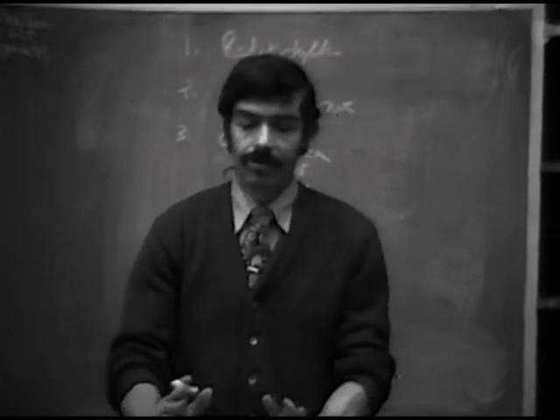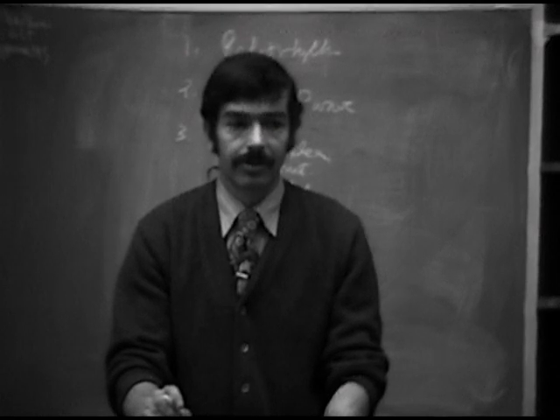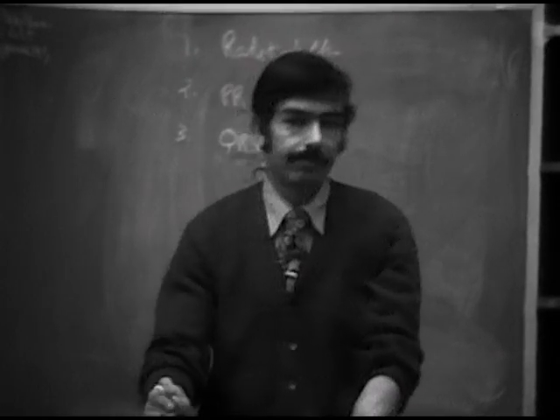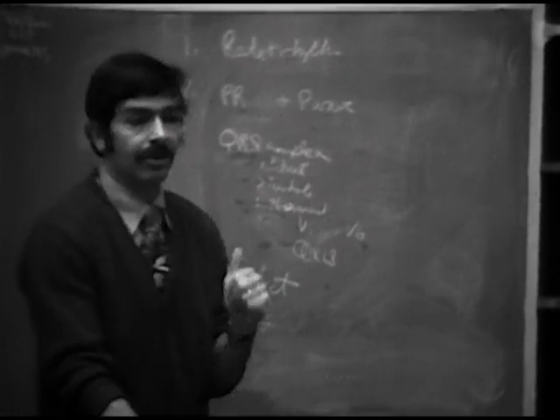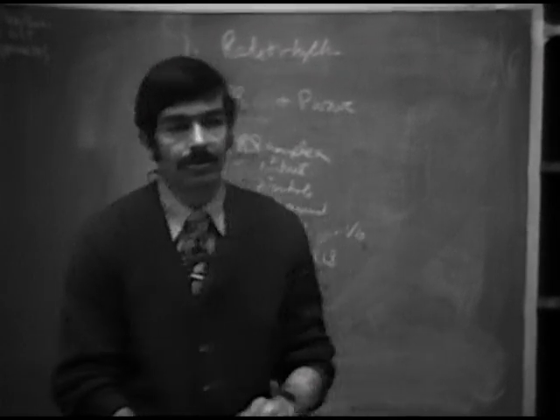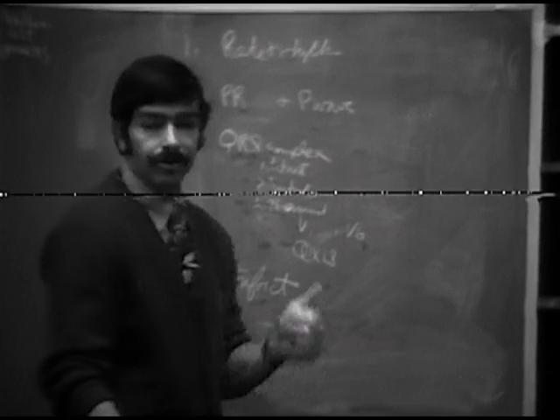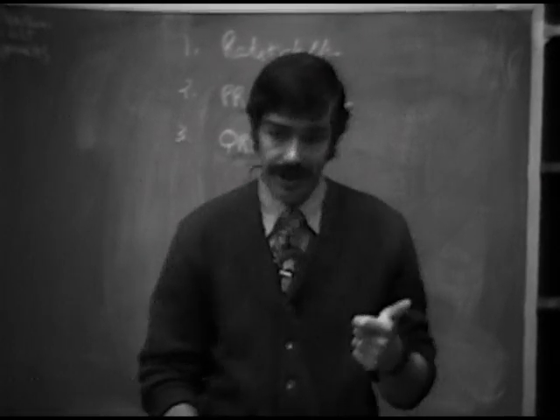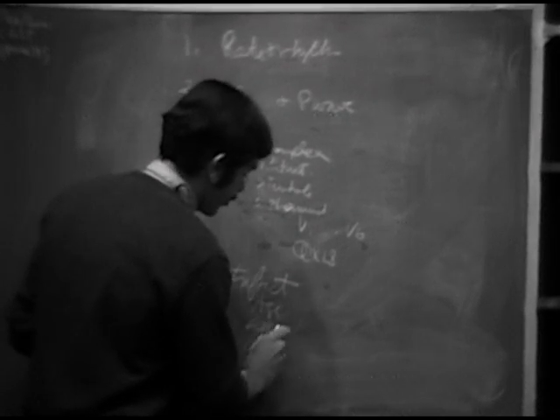If there are no significant Q waves, you look at the horizontal plane and at the R wave progression. R wave progression should proceed in a smooth, normal fashion, as we previously described. If there is no evidence of an infarct based on the lack of Q waves or normal R wave progression, then you go on to the next step. But if you do see an infarct, you want to know two things about it: location and age.